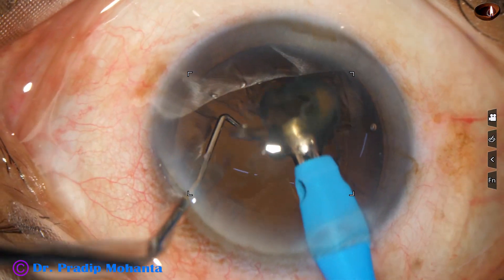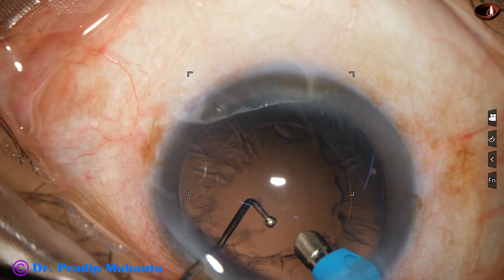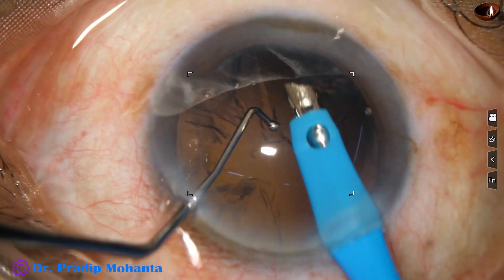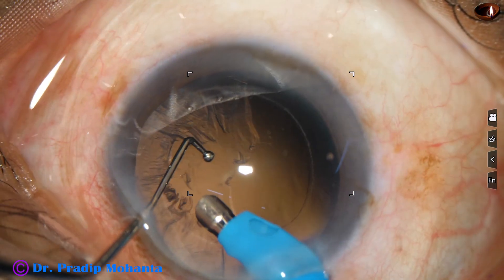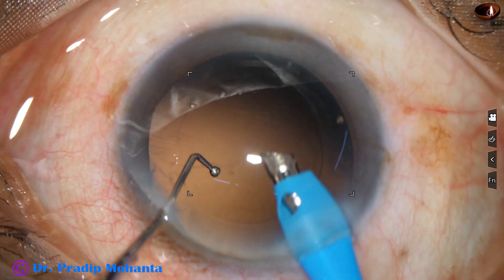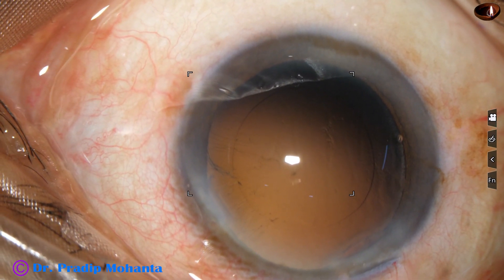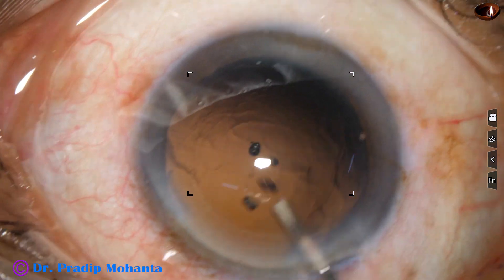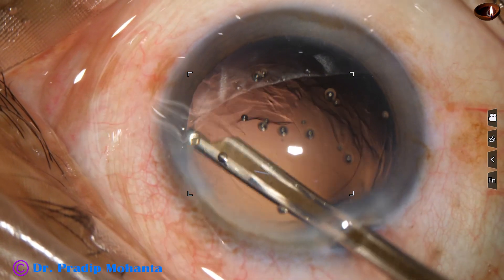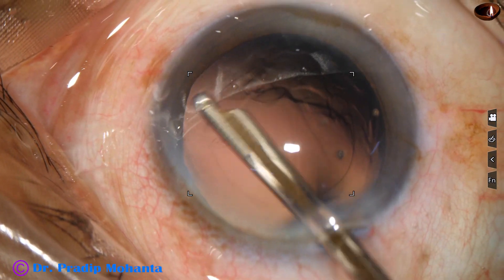This is the epinucleus. This should not be tried by new surgeons — experienced surgeons may try this. This is removal of cortex by the handpiece itself. Most of the cortex has been removed. Some cortical fibers remain at 3 o'clock. I am taking a Simcoe cannula to remove those fibers, as some fibers are sticking to the posterior capsule.